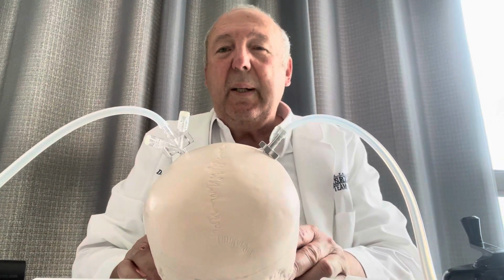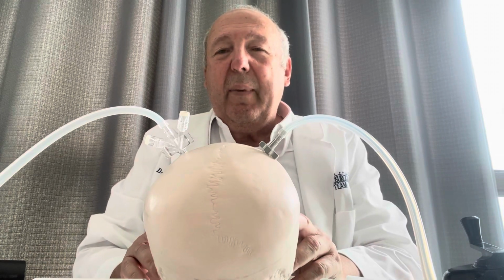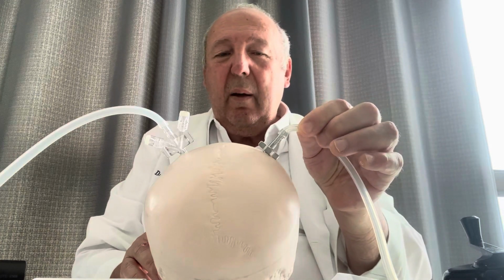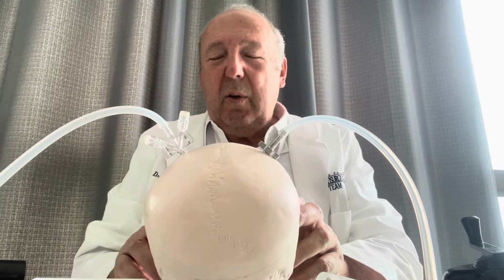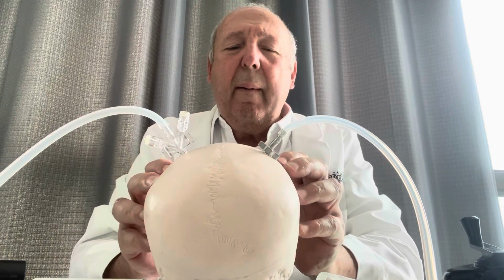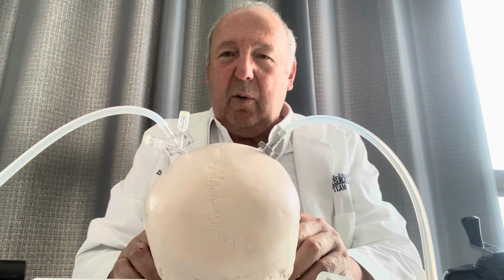I'm a neurosurgeon, and I'm going to discuss today the differences between the subdural evacuating port system, also known as SEPS, and the needle access subdural port, also known as NASP. Both are closed systems for drainage of subacute and chronic subdural hematoma.